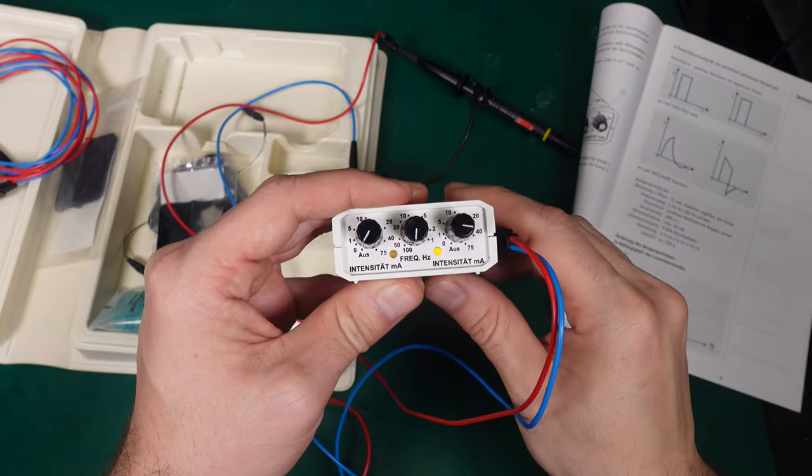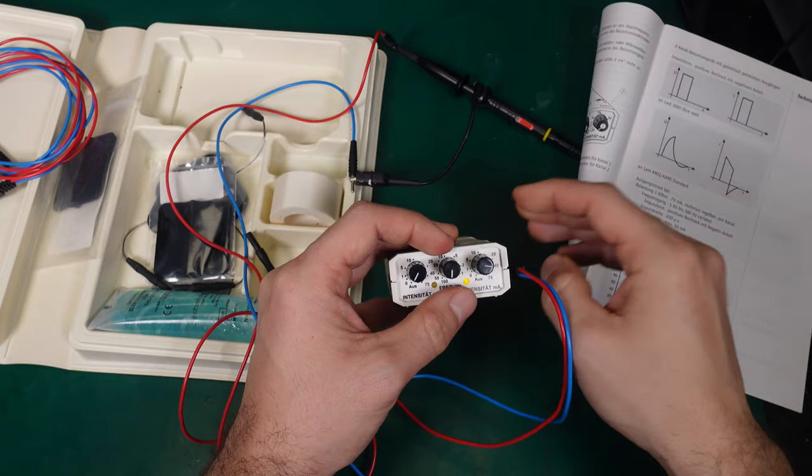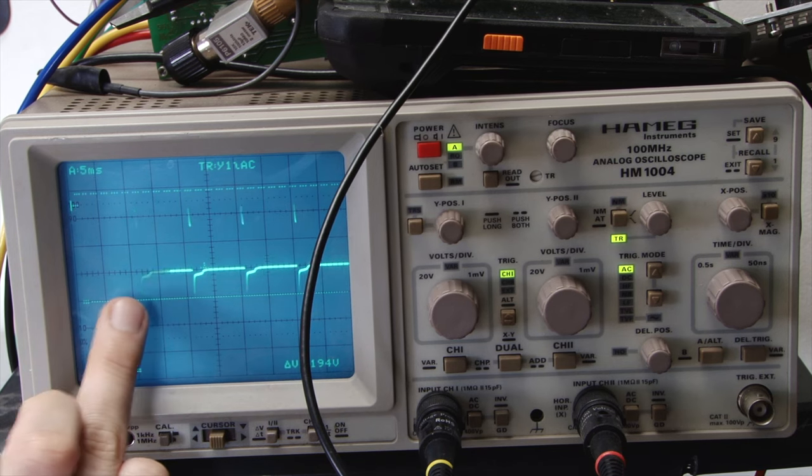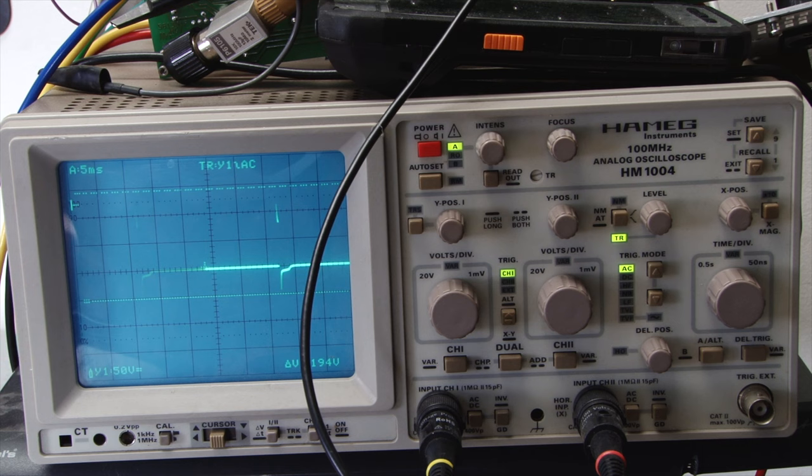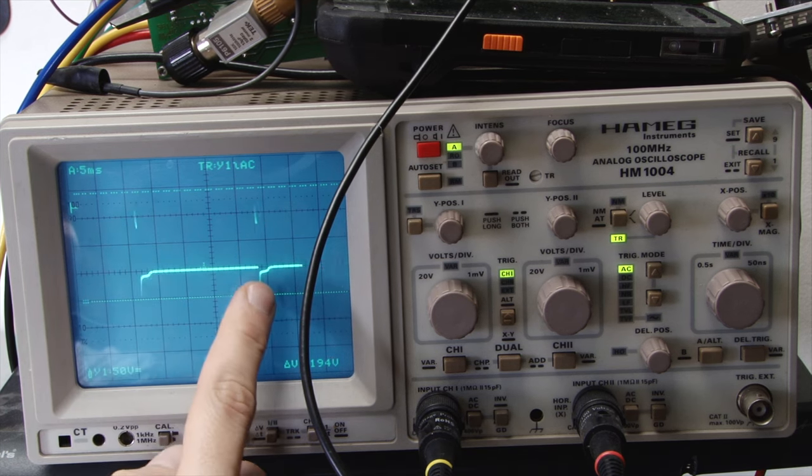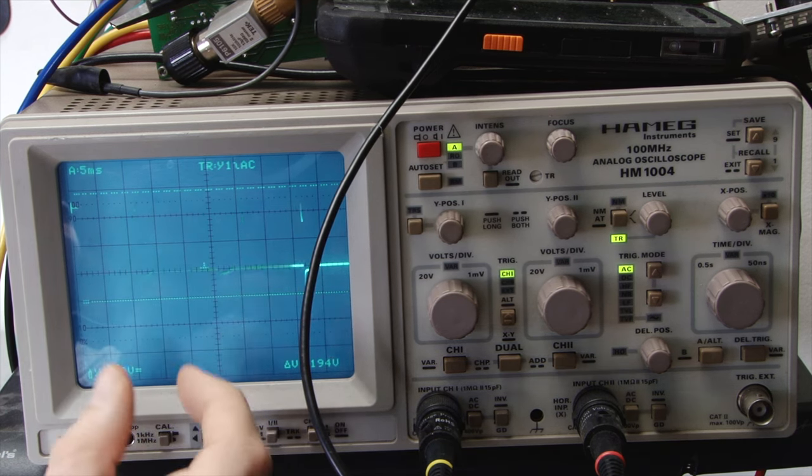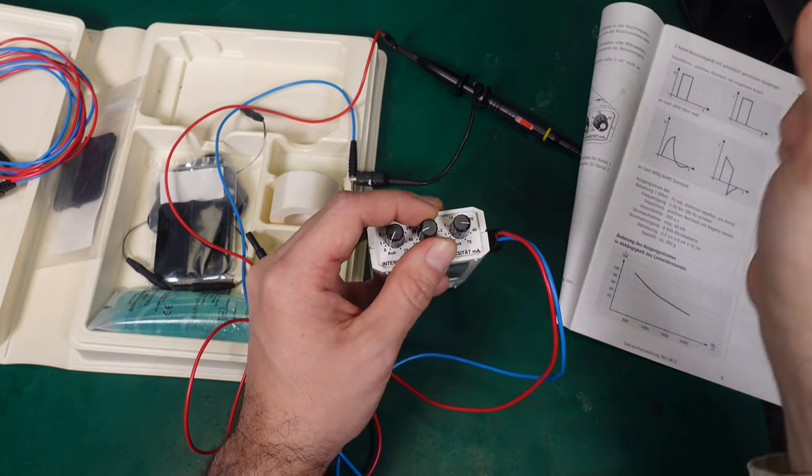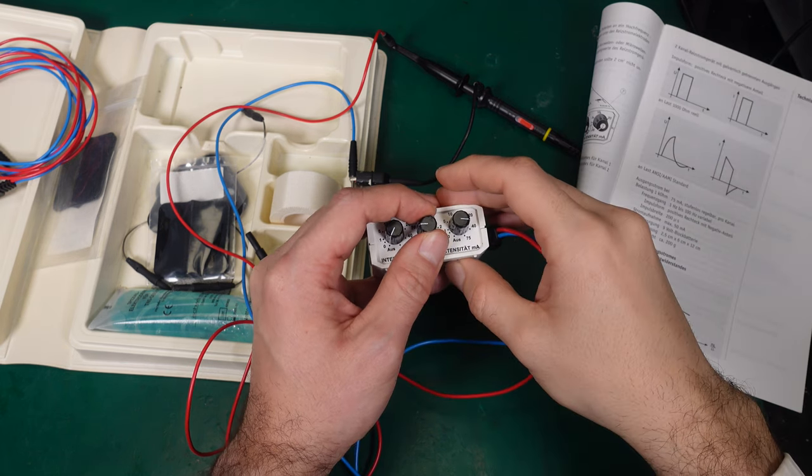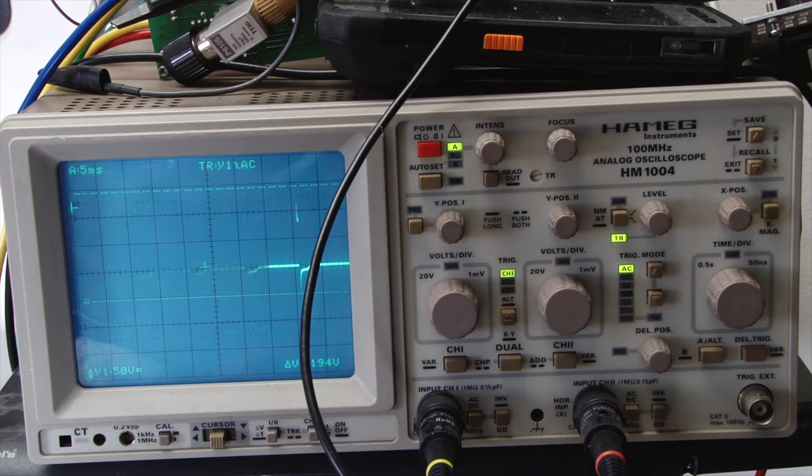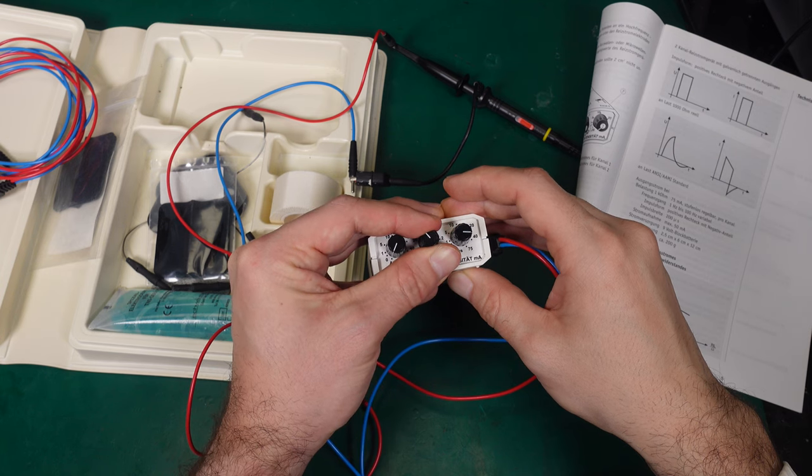On the frequency adjustment, it is quite interesting because it does not change the width of the pulse. As you can see, the pulse is staying the same. We are just changing the frequency of the muscle relax or the frequency of recharging. So it's sending exactly the same pulse even on the lowest and the maximum setting.